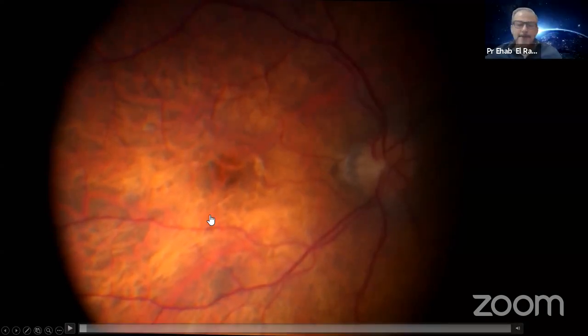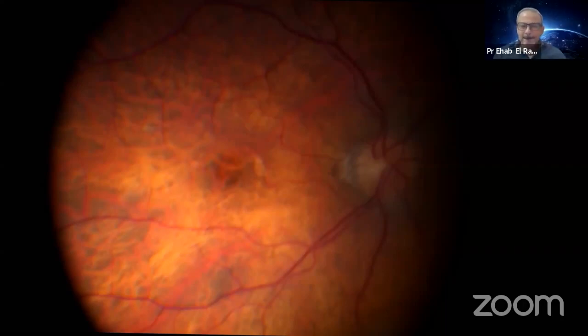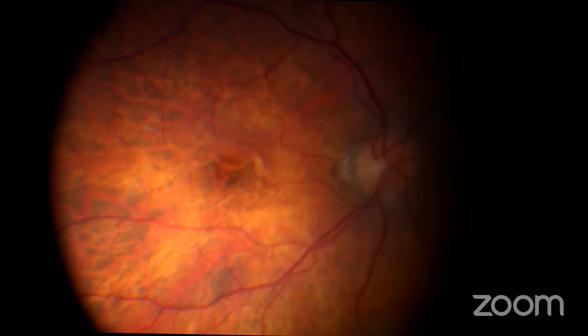Yes. If I may add a small comment, just to differentiate between this type of hemorrhage and the initial hemorrhage that you showed us, the recoil hemorrhage, where you don't necessarily have to raise the intraocular pressure. Here, there is deeper trauma, and you can have subretinal bleeding from such an injury. And this can absolutely spread significantly. So here, I think elevating the intraocular pressure is a must, and probably maneuvering the eye so that the hemorrhage doesn't track towards the macular area.